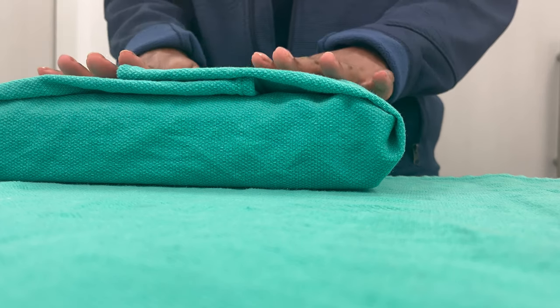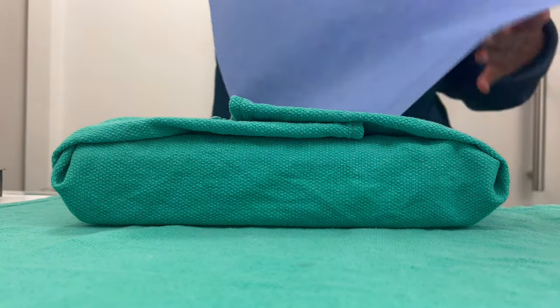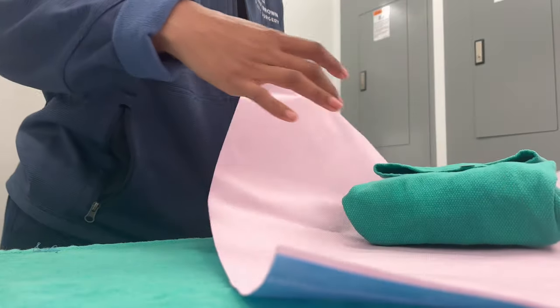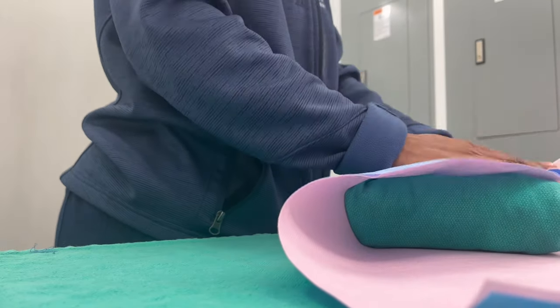And I also put an indicator on top of the towel. So there's an indicator inside the actual tray, there's an indicator on top of the towel, and then I'll put another one in there as well. But here we go. You guys learn how to do this in school, how to wrap.